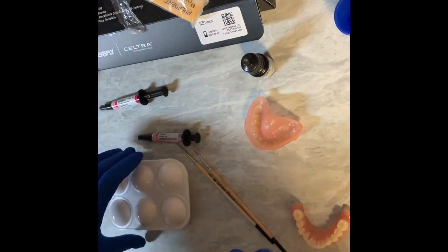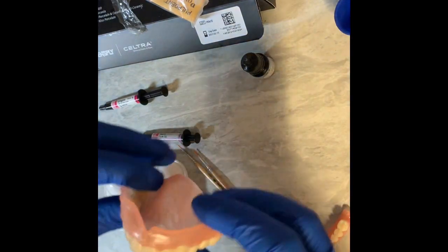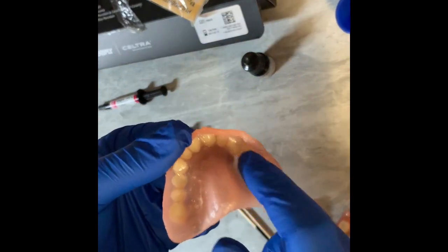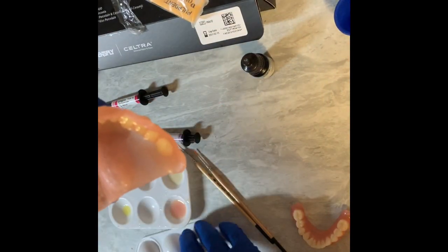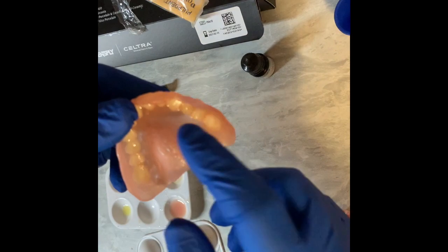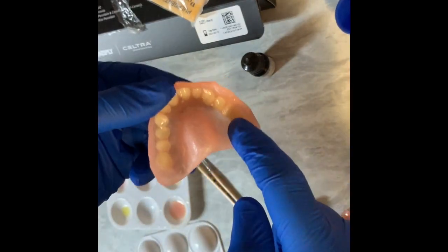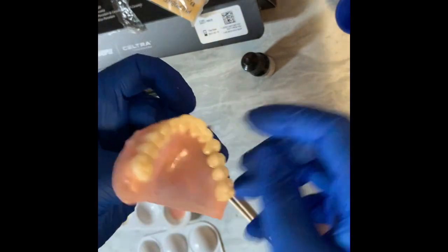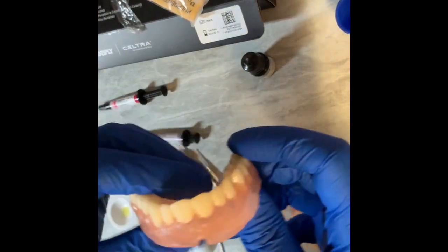So I have these bonded together now. You can see because they're immediate, it's very thin. What I did was, after I had them together and tack cured and everything, I also took a thin layer of the base resin and smeared it in here too. Now everything is just real strong — not going to come apart.